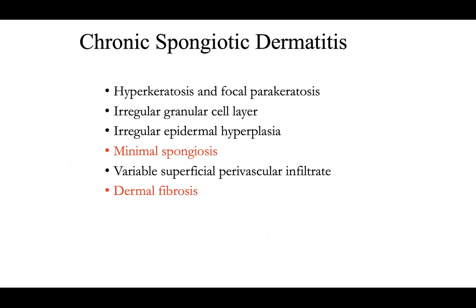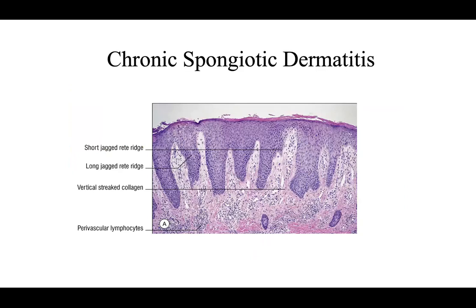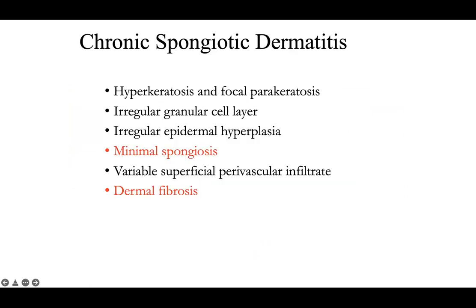is usually characterized by hyperkeratosis and focal parakeratosis. You can see the irregularity of the granular cell layer, but most of the time you have hypergranulosis because you have so much hyperorthokeratosis. That hypergranulosis oftentimes will get 6-7 cell layers thick. Now here it's not fully evolved yet, so it's still kind of in that 2 to 3 cell layer thick stage for your hypergranulosis. But really chronic lichen simplex chronicus will have very thick orthokeratosis and 7, 8, sometimes 10 cell layers thick of the granular layer.